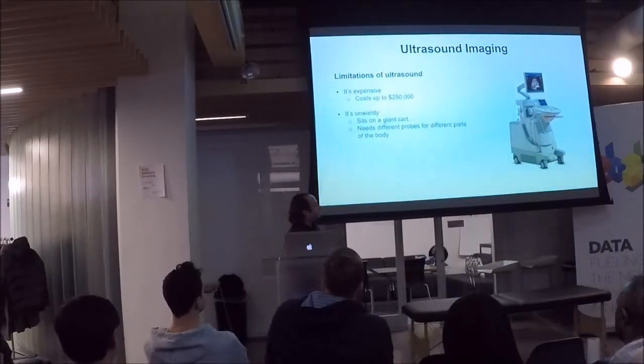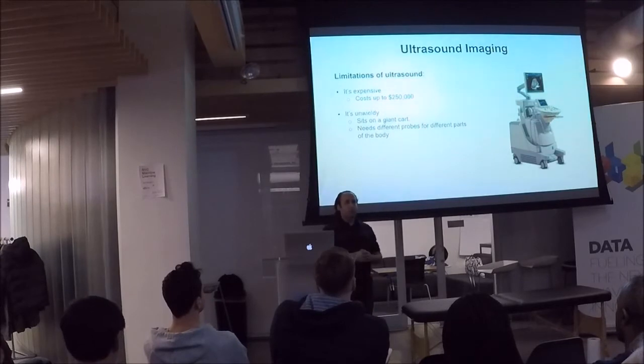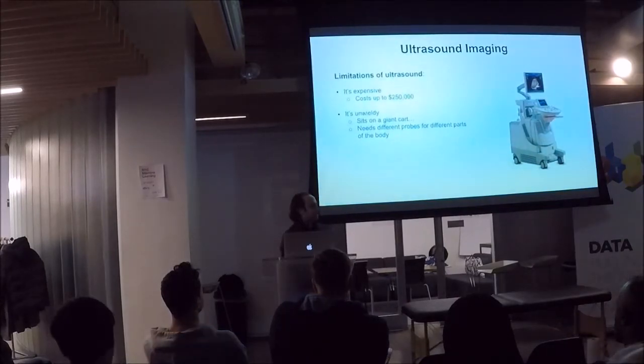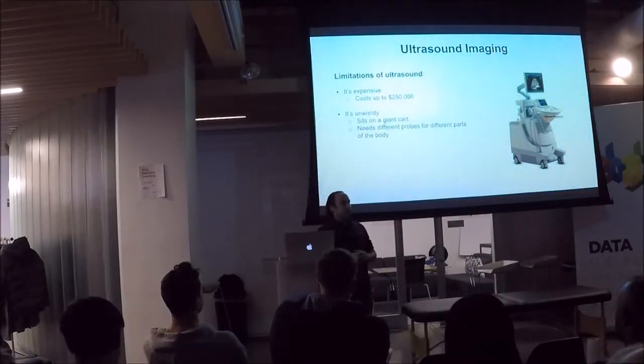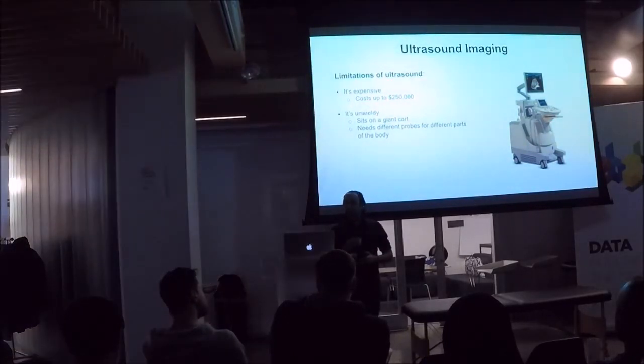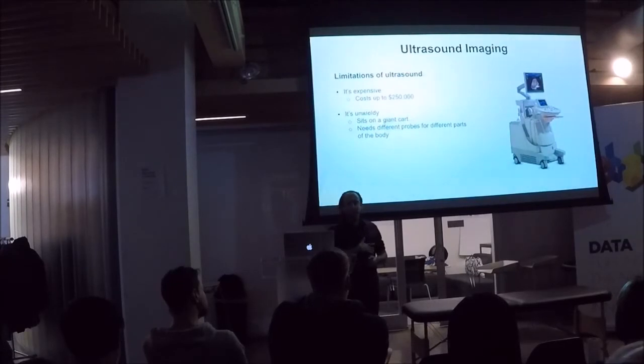And one of the real limitations is that ultrasounds require different probes for imaging different parts of the body. The reason is that all ultrasound devices use piezoelectrics, so it's a crystal that you pass a current through. It vibrates at a particular frequency, and you need different frequencies to image different parts of the body.